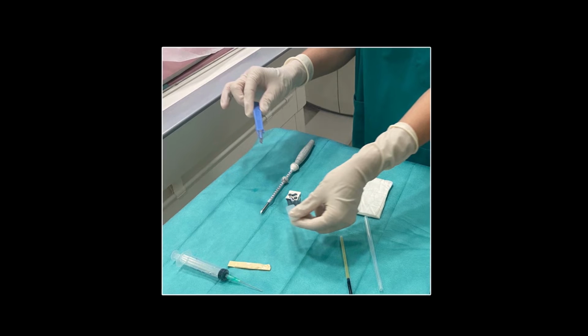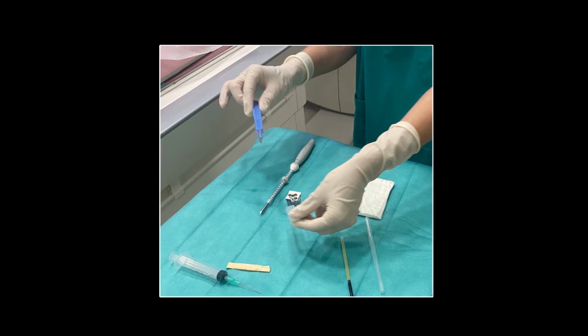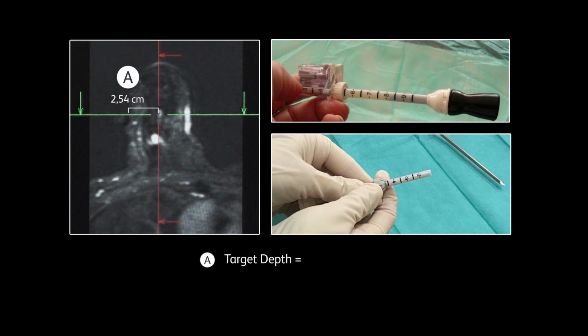A skin incision can be done as required, but is not necessary for the current procedure. Set up the VisiLock MRI introducer set according to the introducer depth found before.